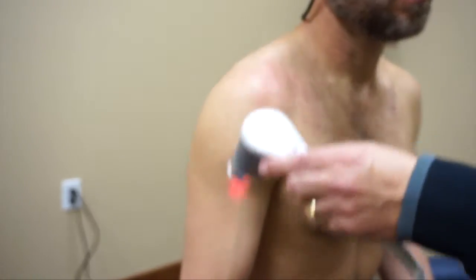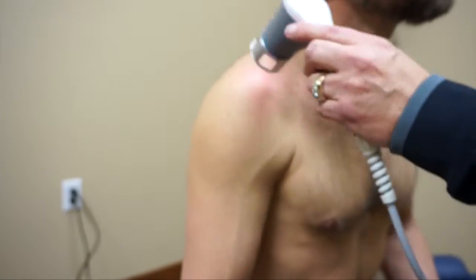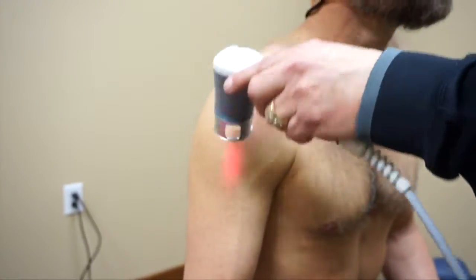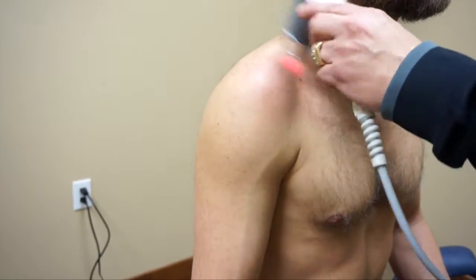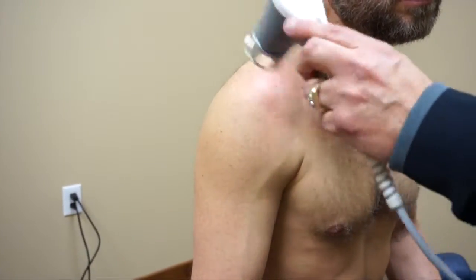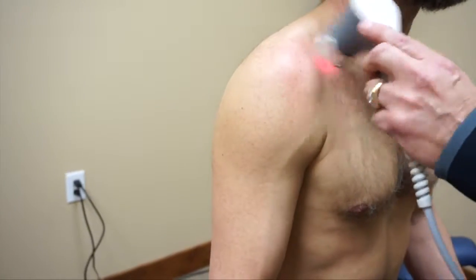Inside the body, the photons have two choices: they can either be accepted by the cell if the area is inflamed, or if it's a healthy cell, the photons just pass right through it. This is important so that you don't over-treat the area.